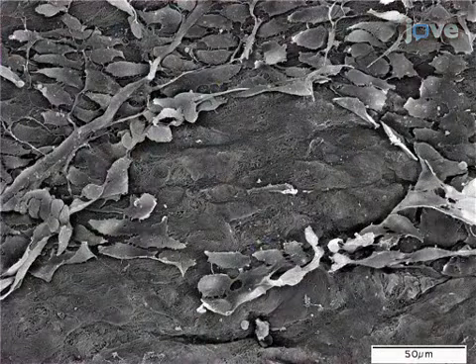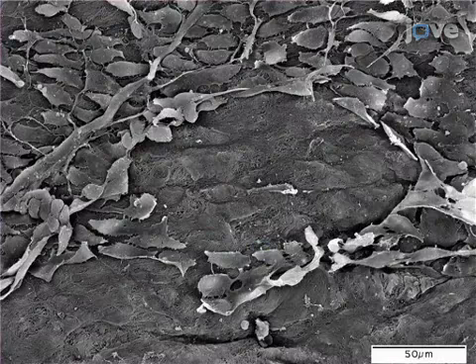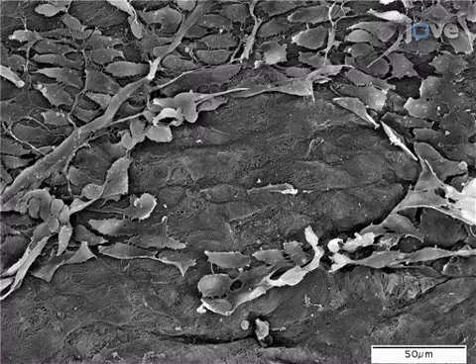Results are obtained from scanning electron microscopy that show that this approach removes invisible endometriosis that affects the underlying peritoneal cells, which in turn provides menstrual or ovulatory blood access to the sensory nerves that innervate the pelvis, causing pain.